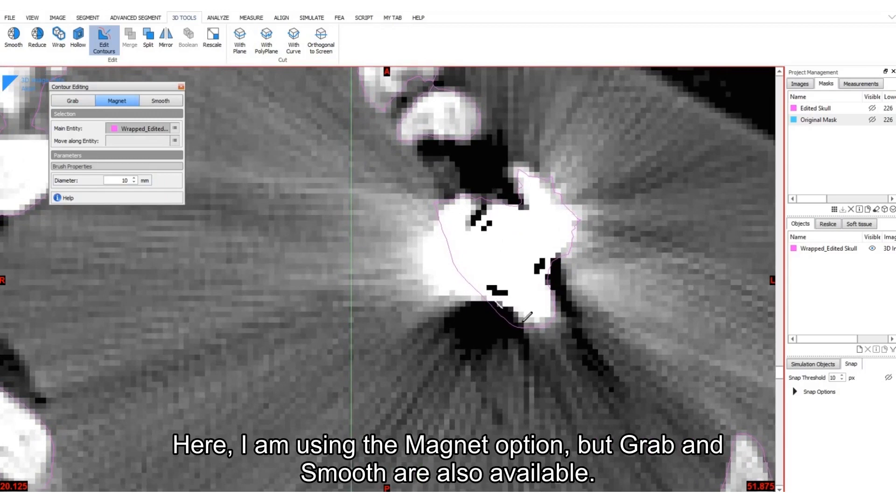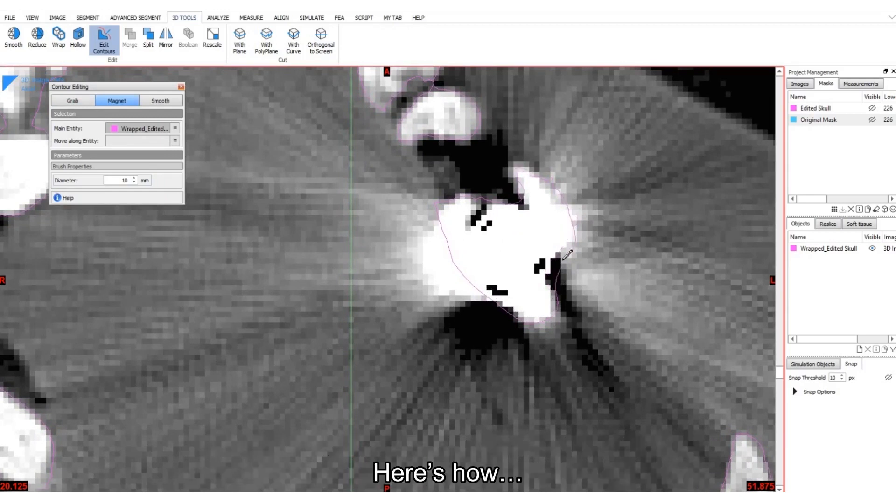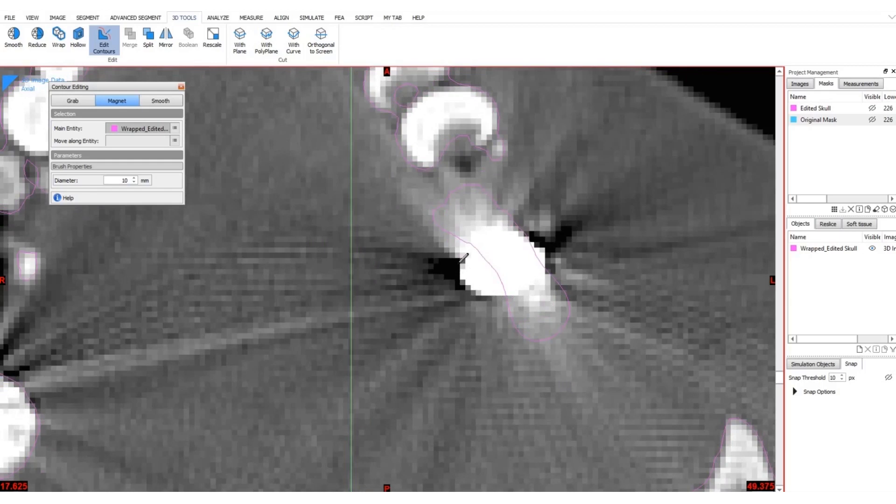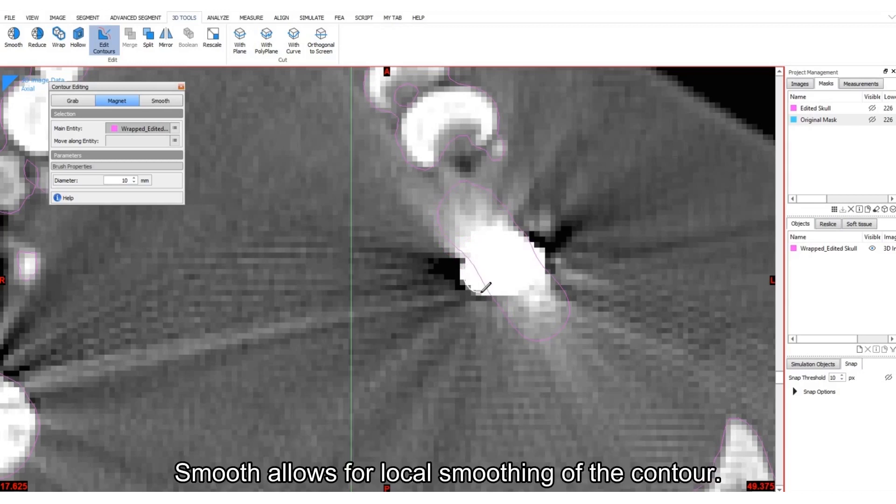With the magnet option, you can directly draw on the images and the contour will be updated. Here's how. You can also use the grab feature by dragging the contour to the ideal location. Smooth allows for local smoothing of the contour.